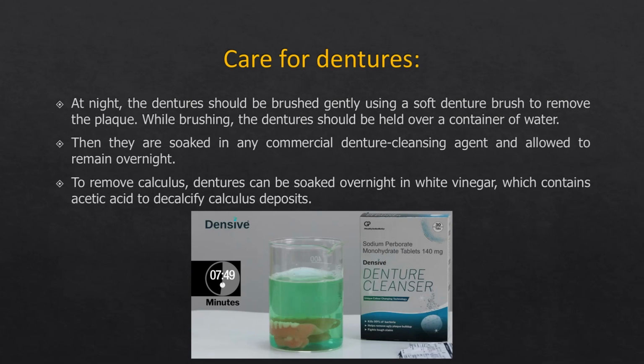Nowadays, all the denture product manufacturing companies make denture cleansing tablets or denture cleansing solutions. Basically, the denture should be occasionally placed in a water bath containing commercial grade denture cleansing tablets, which mainly contain sodium perborate. Dentures can usually be left from half an hour to overnight, but it is preferable that dentures not be kept overnight, although I have written overnight here.